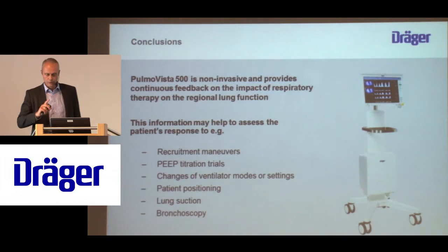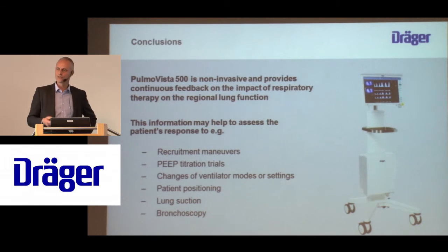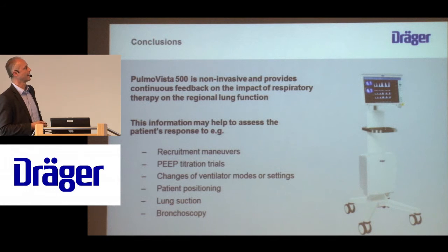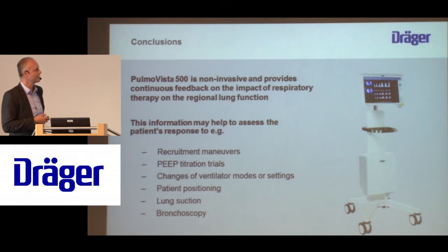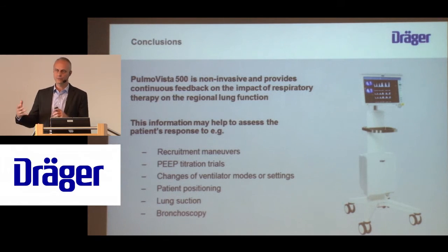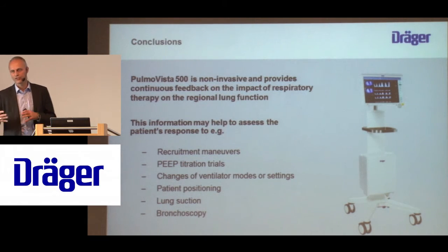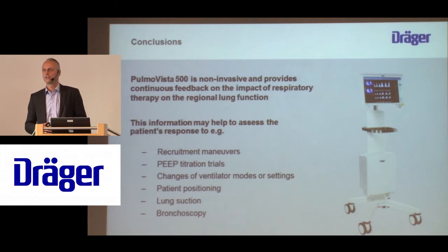Okay, so to conclude on this part, I think electrical impedance tomography and our new device helps assessing the patient's response when you do recruitment maneuvers and PEEP trials, but it's also capable of displaying the effect of changes of the ventilator mode, for example going from SIMV ventilation to APRV.